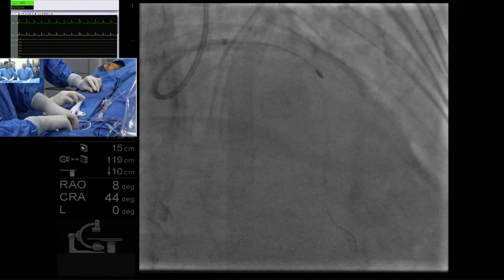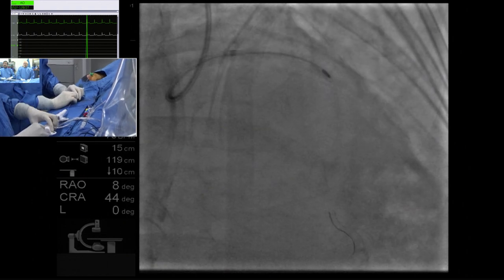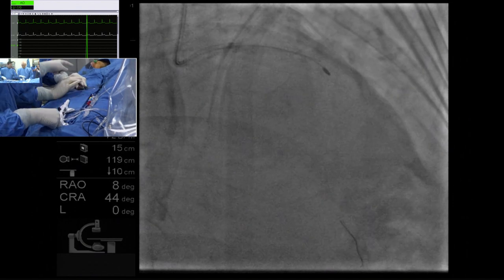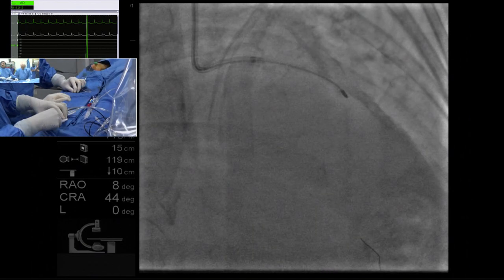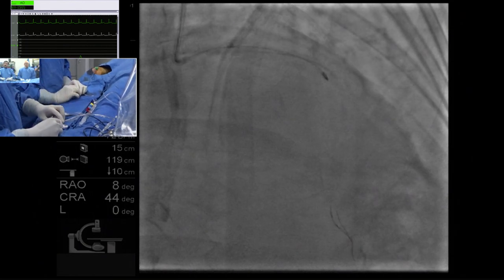I think one of the important things about rotational atherectomy also is you never want to stop the burr in the lesion. That's how you end up getting trapped. It's more of a pecking motion and coming back proximal to the lesion. I think the guide is a little bit deep seated, right? You want to get the guide out a little bit?